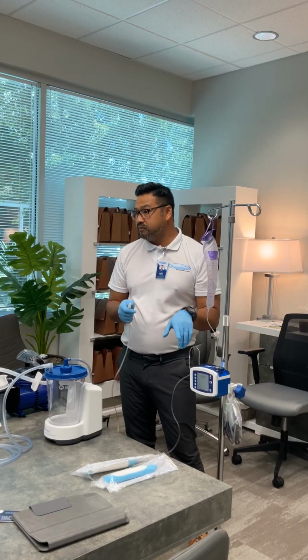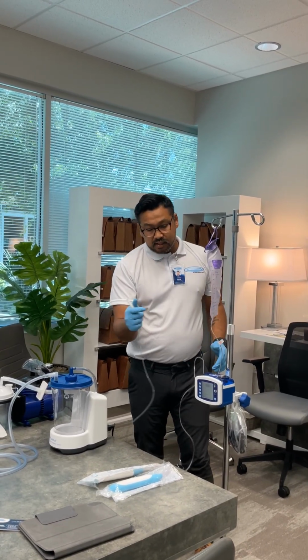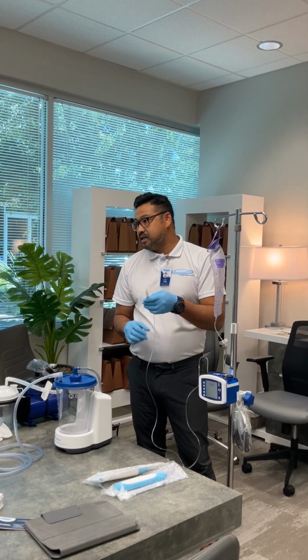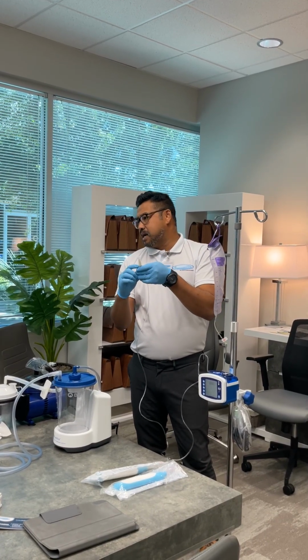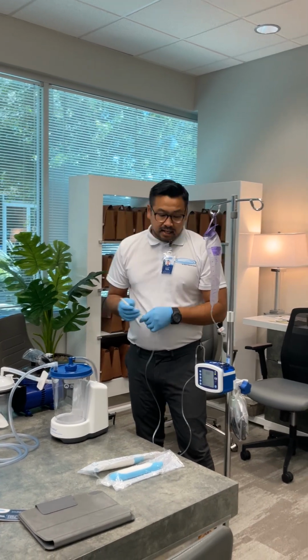So there's a manual version where you press and hold it to get it as close to the end, or the auto prime where it just does it on its own and kind of detects where the end is, but it still leaves a little bit of a gap sometimes, so you're going to get some air into the patient, so that's not what you want.